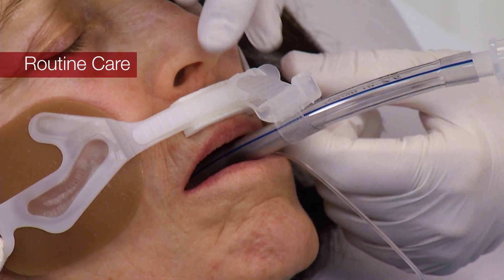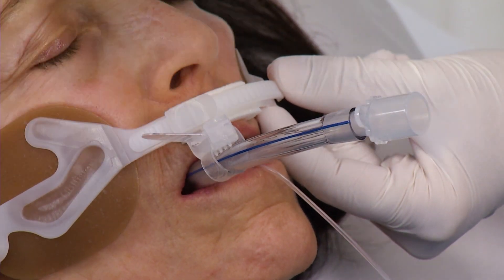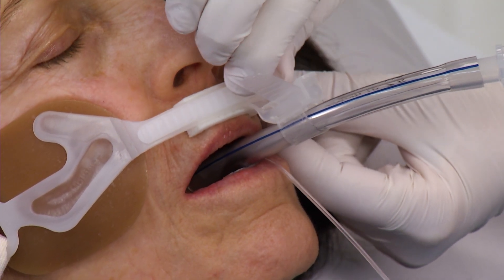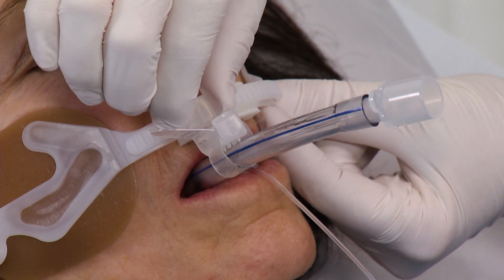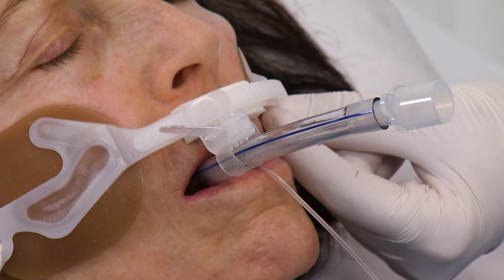To reposition the ET tube, squeeze the gliding tube shuttle tabs on the outer edges and move in either direction along the track. Reposition the ET tube from side to side at least every two hours or more frequently if the patient's condition dictates, to minimize the risk of injury to the skin and or lips from unrelieved pressure and shear forces.